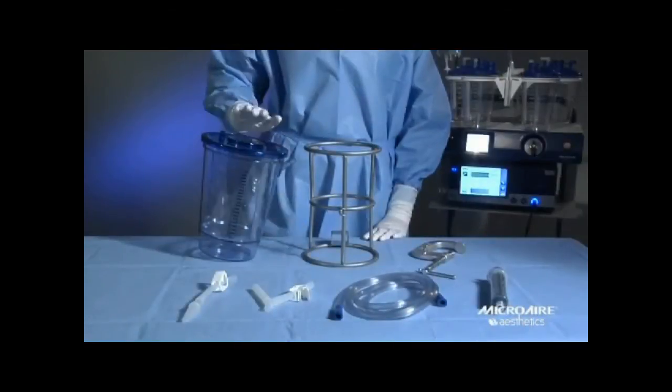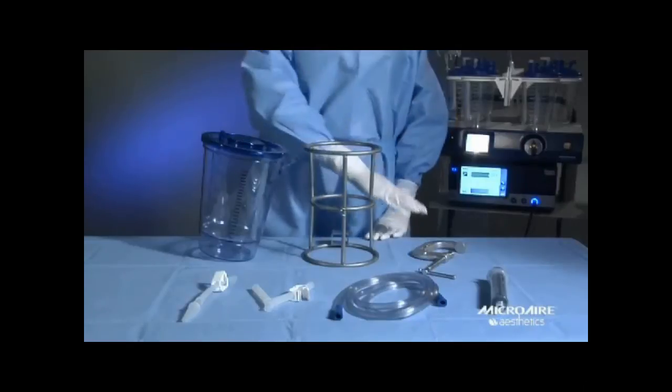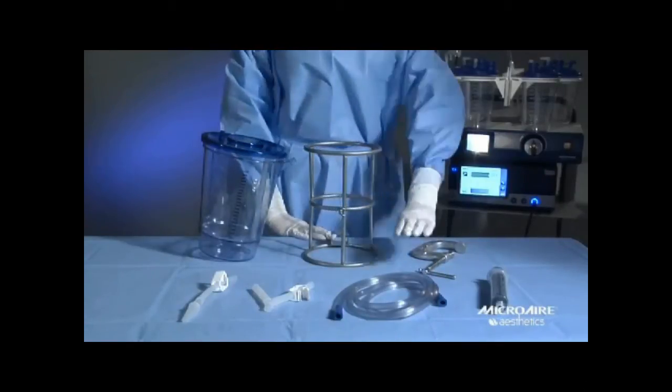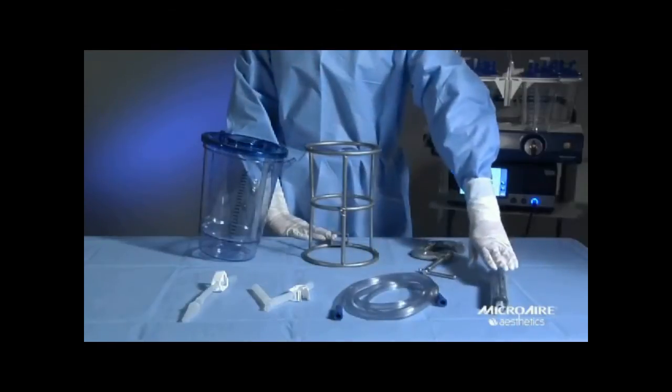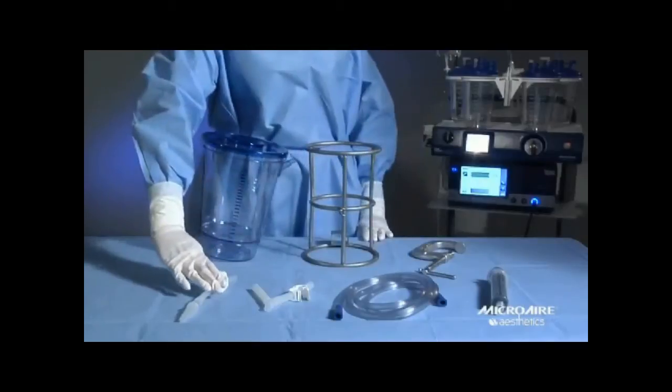To get started you will need the lipo filter harvest canister, a stainless steel stand and clamp. Inside each canister box you will find sterile transition tubing, a tomy syringe, the fat evacuation tube, and the vacuum manifold.